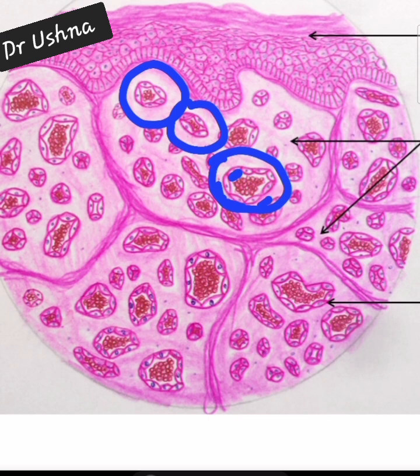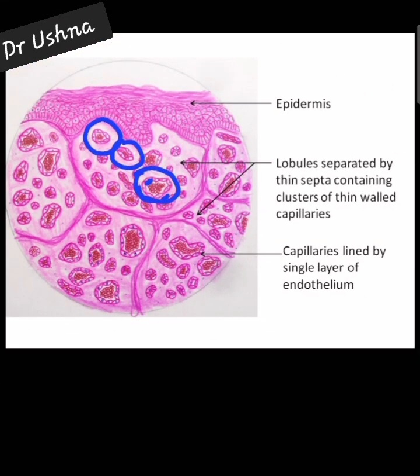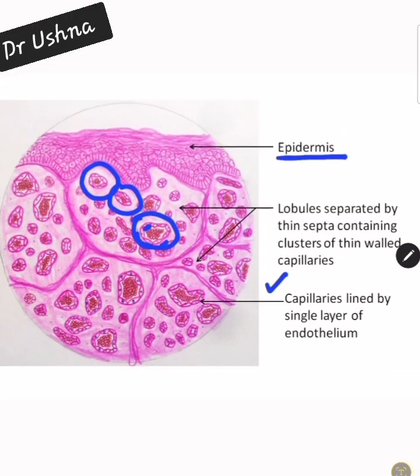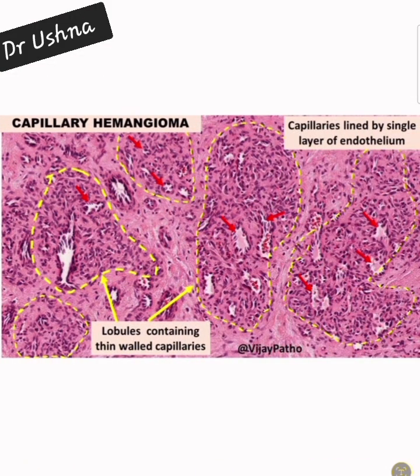The whole collection of capillaries forms a lobular arrangement. You can see normal epidermis, then lobules of different capillaries separated by septa, and the capillaries are lined by a single layer of endothelium. This is the basic concept of hemangioma when you see the different pictures in microscopy.